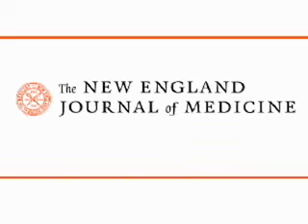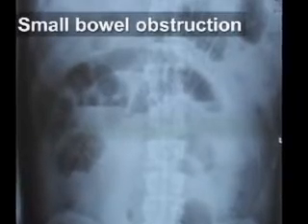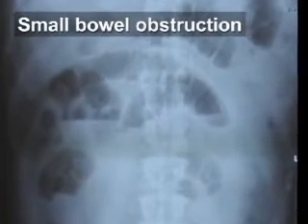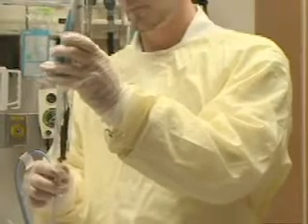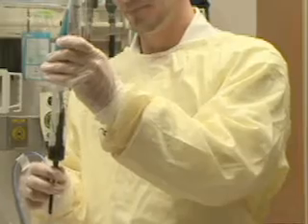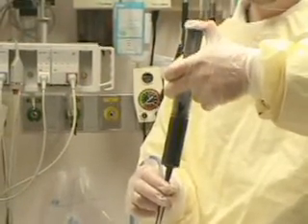This is a video in clinical medicine from the New England Journal of Medicine. Common indications for nasogastric intubation include decompression of the GI tract in patients with bowel obstruction and gastric emptying in intubated patients to prevent aspiration. NG tubes may be placed as an adjunct for the delivery of oral agents such as activated charcoal or oral radiographic contrast media.